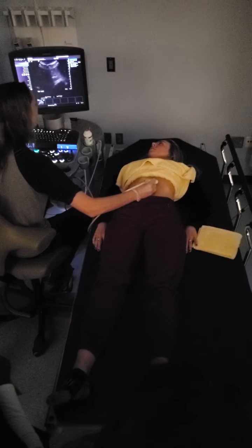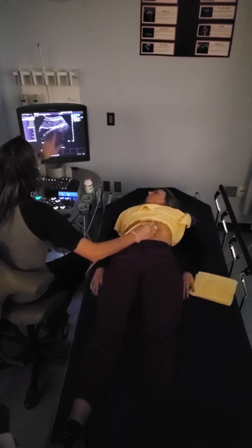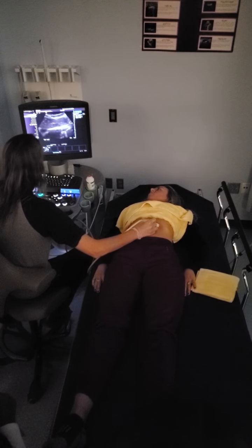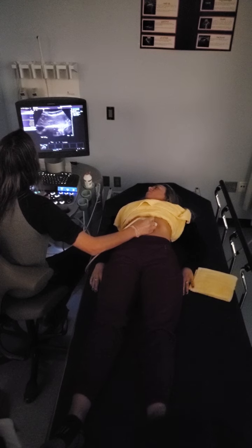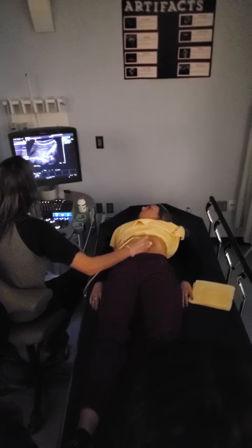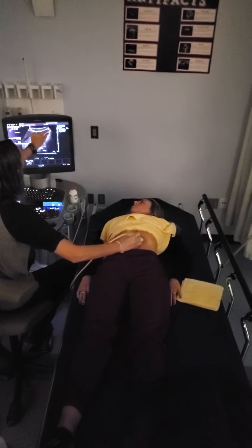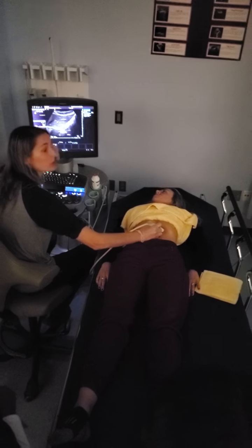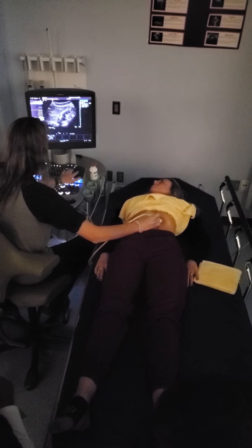Okay, big breath. Okay, so here we are all the way up in the thorax. Coming in, we're collecting that lateral border. So there's our first image. Coming down again, and the left liver lobe in this kind of mid area, it's a little bit more triangular shaped. So we really want to make sure that we're not cutting off even the smidgiest, because this is your street cred, right? You want to look cool with your friends.